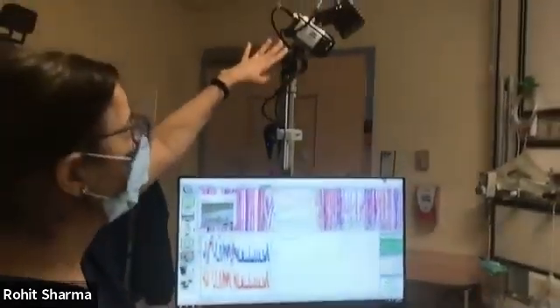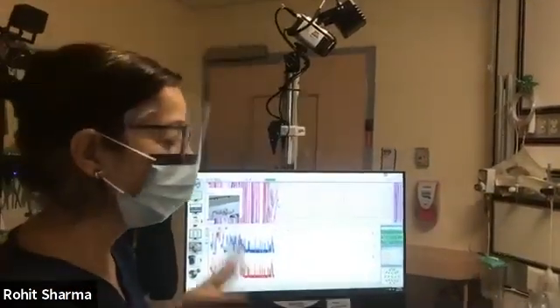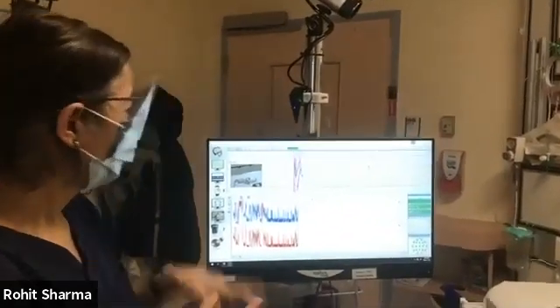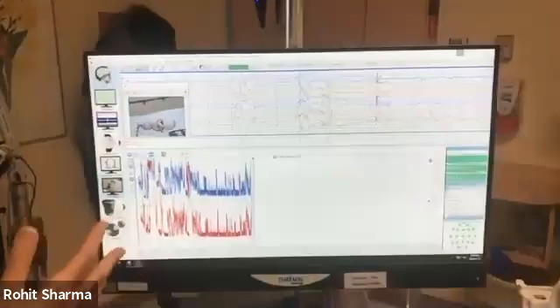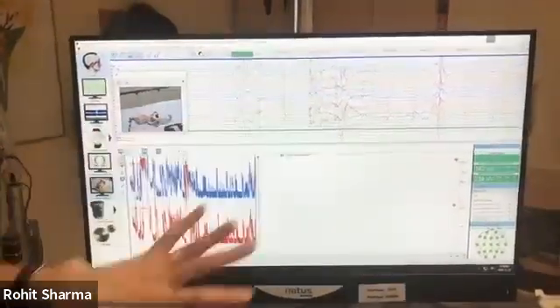The important thing to remember is that this is a video EEG. There's a camera, there's a microphone, and we have an infrared light in case you want to record the EEG and it's dark and quiet and people are resting in the ICU. This is a real recording that we're doing. Of course, not a real EEG, but we have a patient who's a doll that we're using. The ICU system is set up and it looks something like this.